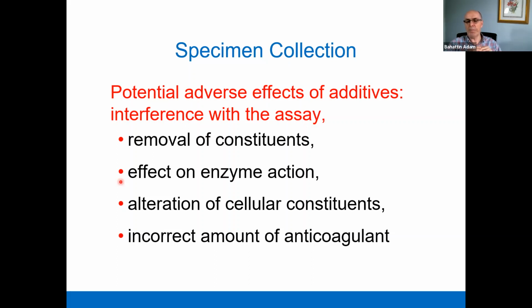You have to consider this proportion, usually 1 in 10. 1 portion anticoagulants, 9 is whole blood.